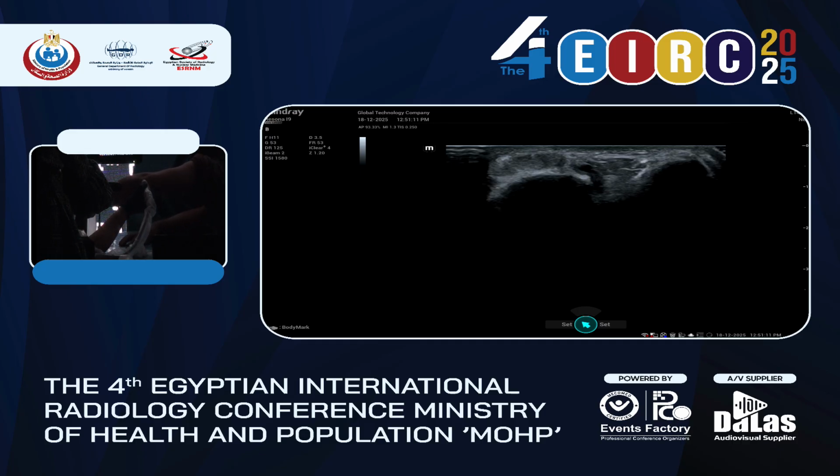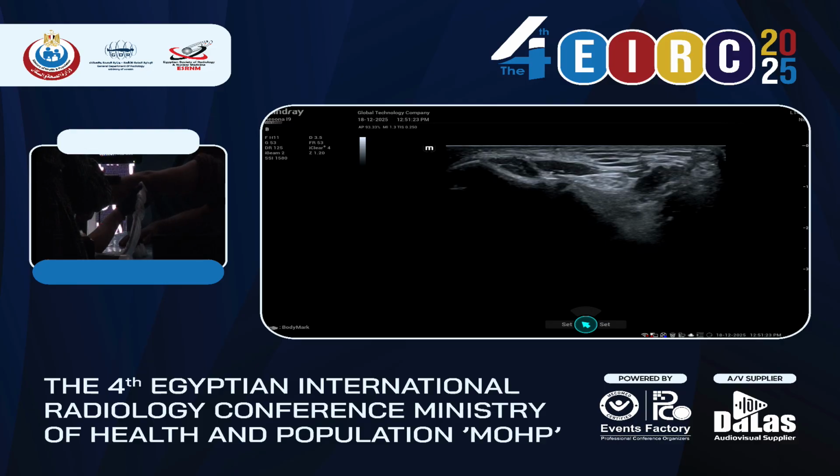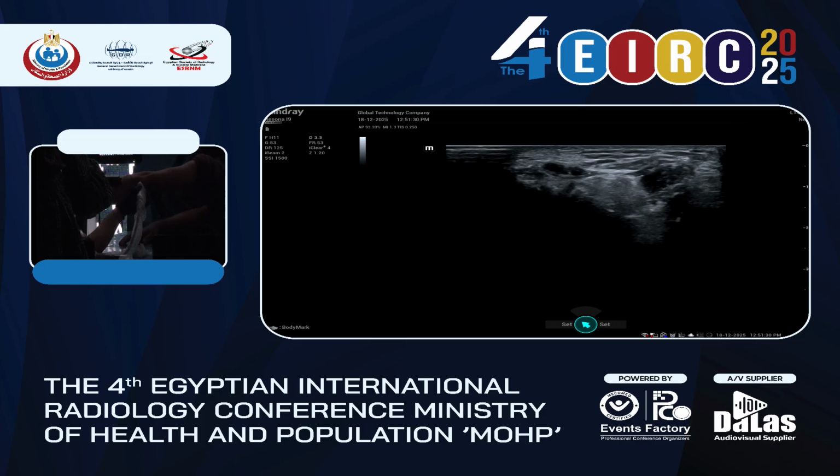So this is the entrance of the cubital tunnel underneath the Osborne retinaculum. And when you move more distally, you see that the nerve goes inside the true cubital tunnel. Now, the true cubital tunnel is between the two heads of the flexor carpi ulnaris. So the nerve is here in the middle.